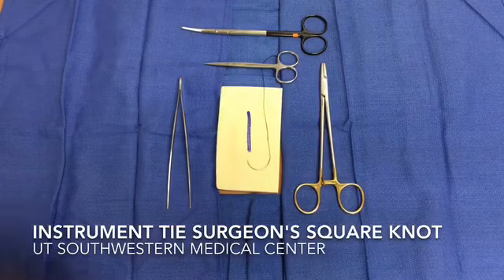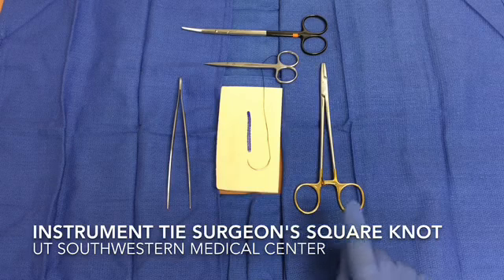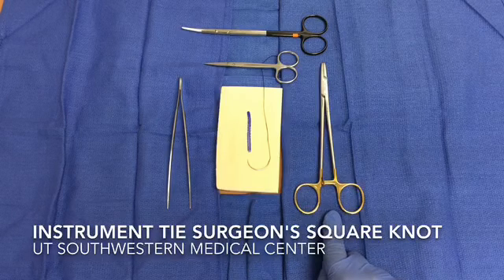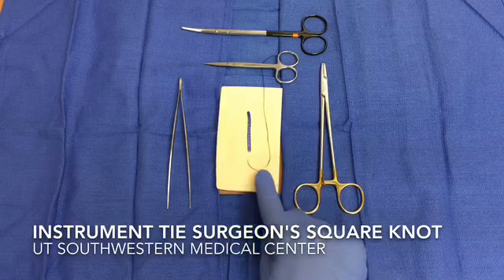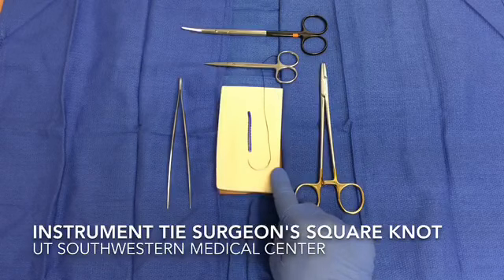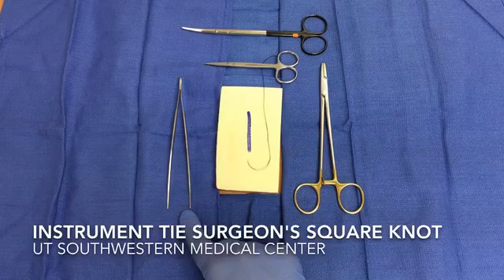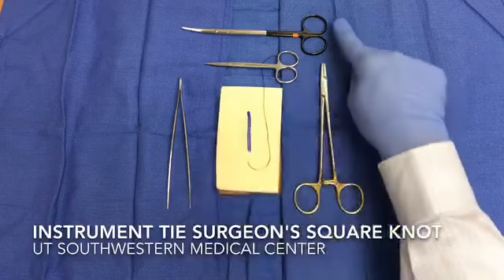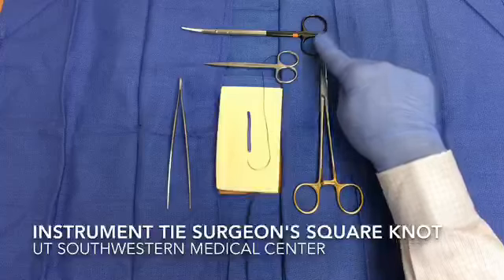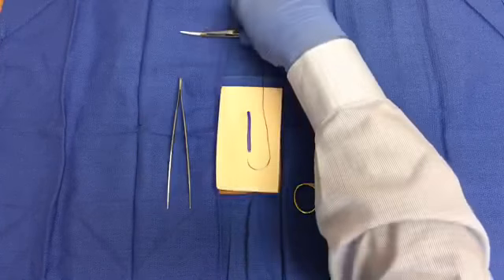For the instrument tie surgeon's knot exercise you will need the following items: a needle driver, suture material, a foam pad to practice on, skin forceps or forceps with teeth which are not shown, heavy suture scissors which are also not shown, and scissors from a suture removal kit.